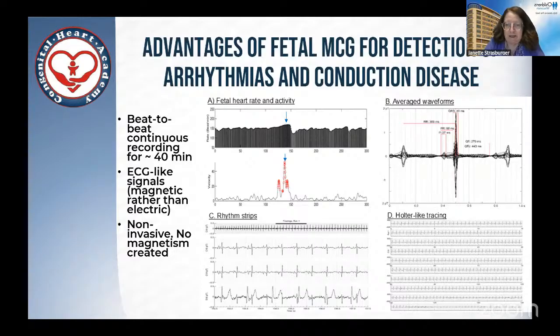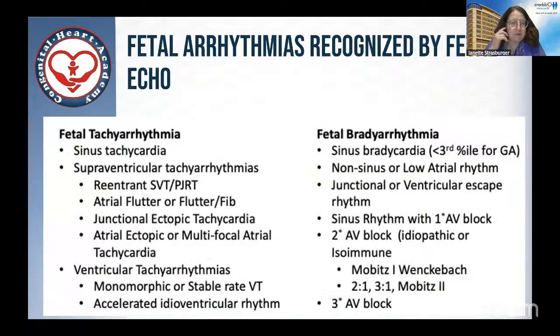And finally, we do full disclosure so that we can present this eventually to the FDA and have them believe that this is really what we're seeing. So this is just all the different arrhythmias that we can determine by echo. And this is a lot, and this is really good. But what I want to talk about today isn't this.